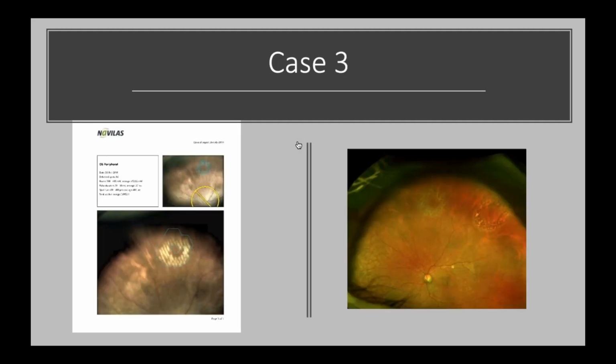The third case is an interesting myopic patient who was treated for retinal tear about 2 weeks previously. When she came back for a review, she was found to have another retinal tear adjacent to the previous one. The laser reaction around the previously treated tear is clearly seen to be well developed, and the fresh laser burns are seen around the new tear.